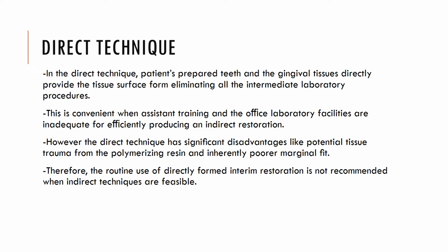However, the direct technique has significant disadvantages, like potential tissue trauma from the polymerizing resin and inherently poor marginal fit. Therefore, routine use of the direct technique for provisional restorations is not recommended when the indirect technique is feasible.